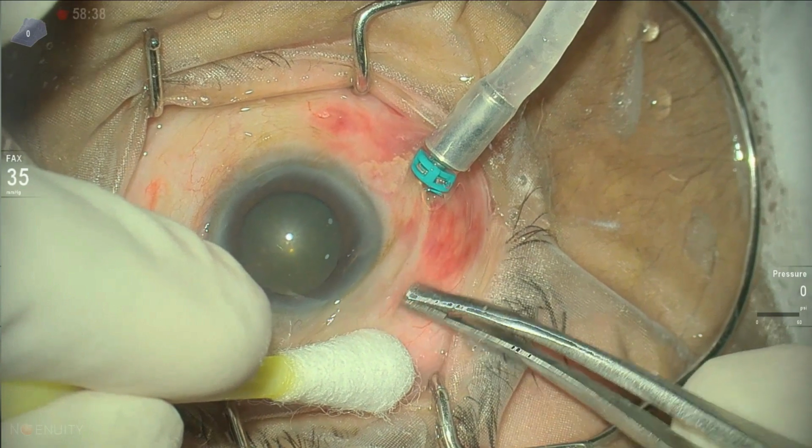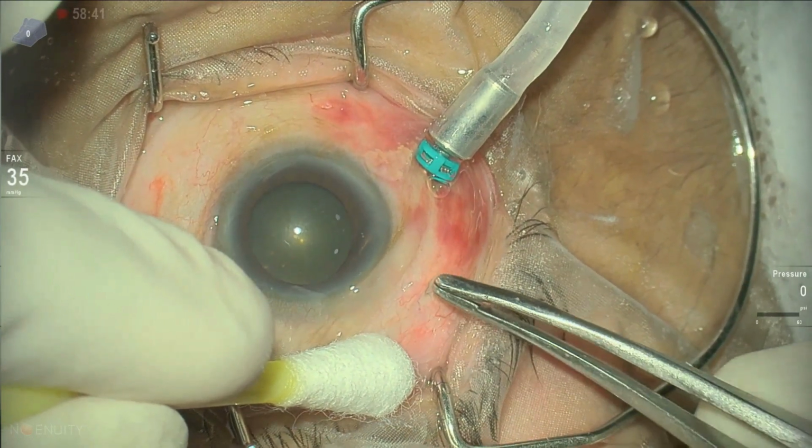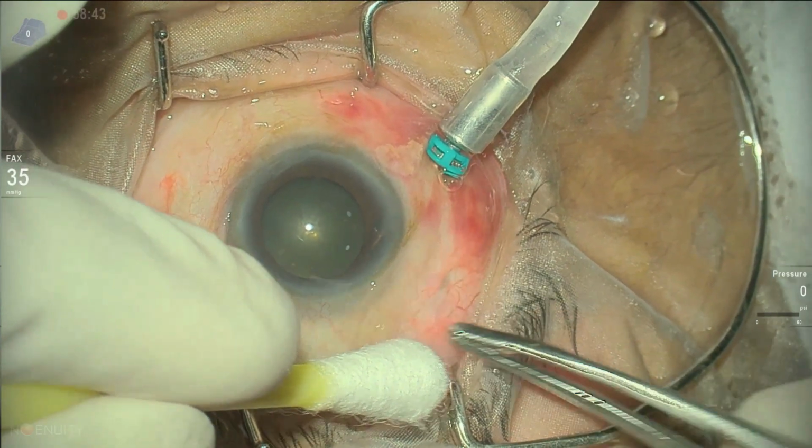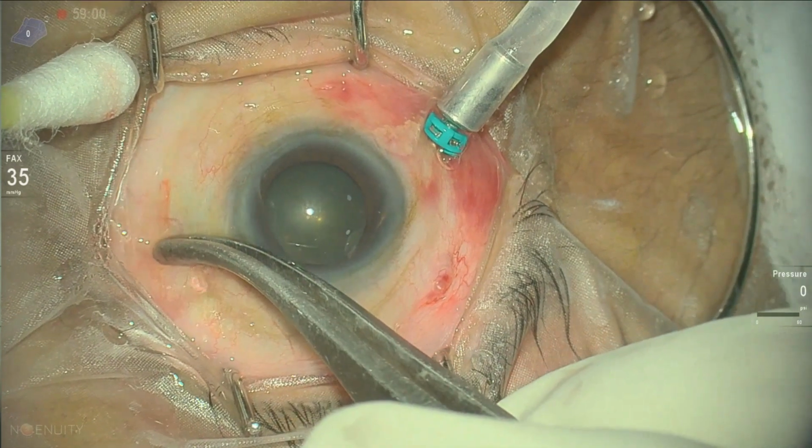After completely filling with the silicone oil, we remove the second port and wait for the silicone oil to trickle back into the globe.